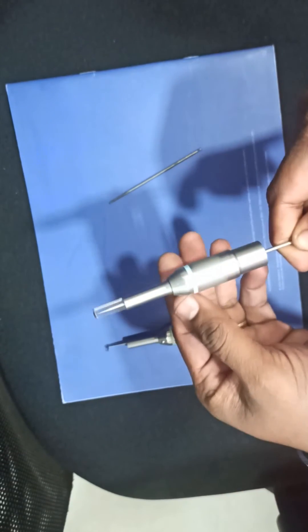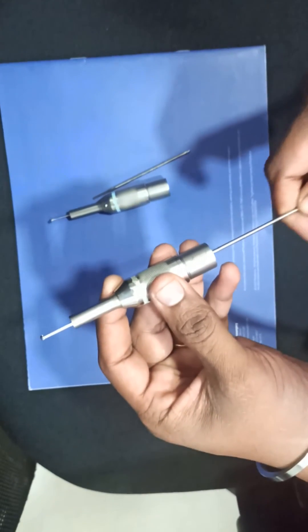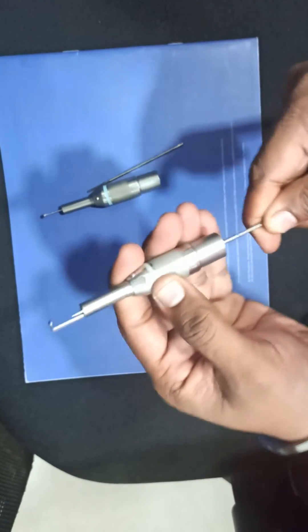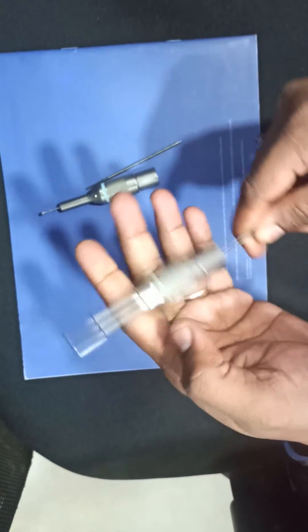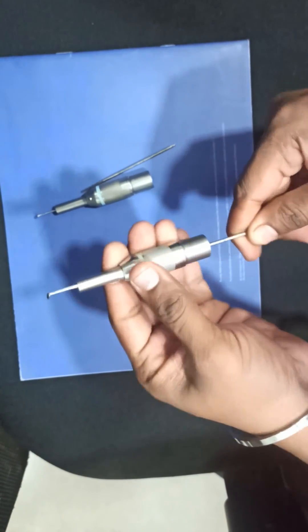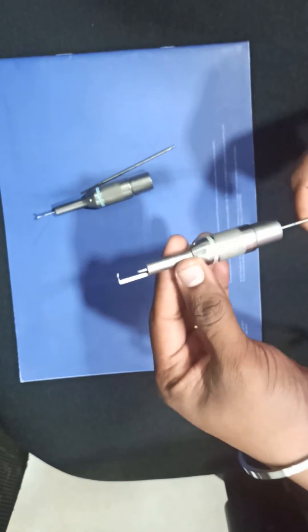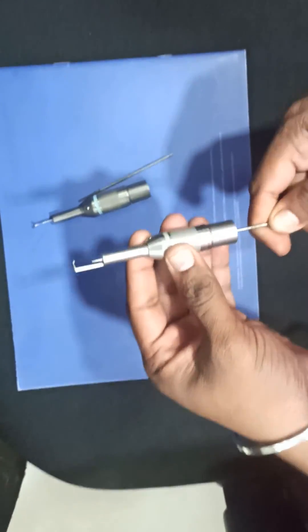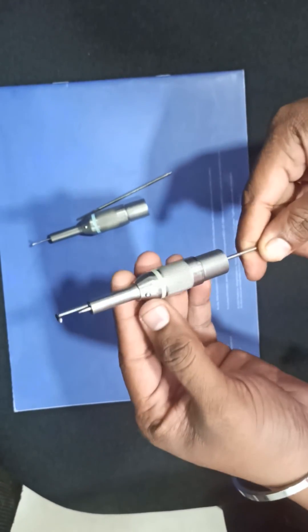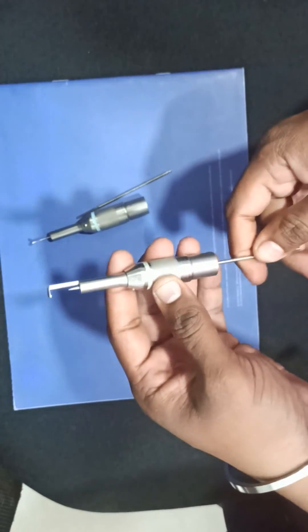If I insert it in this attachment now, see that it is going inside and it is getting stuck somewhere. So it shows that this attachment is defective. Like this you can easily identify the condition of the attachment and tools. Thank you.